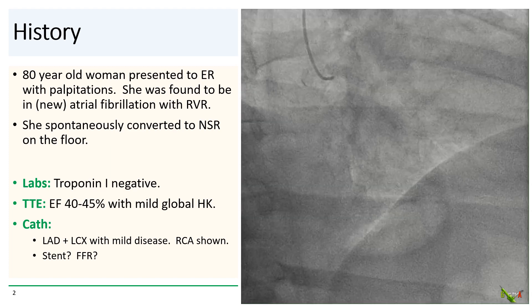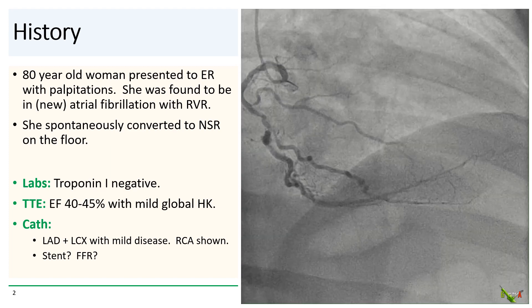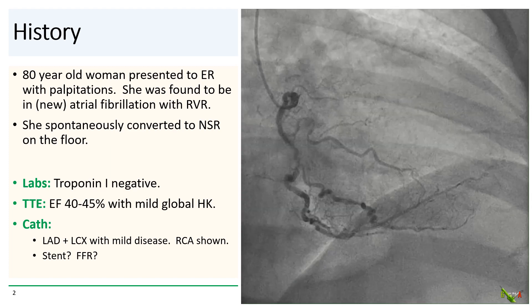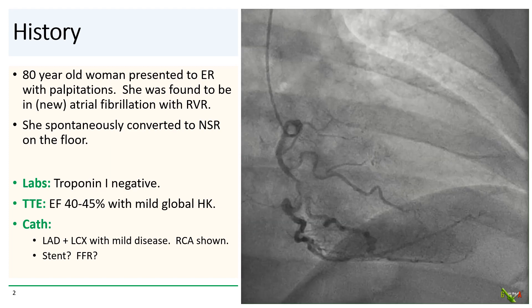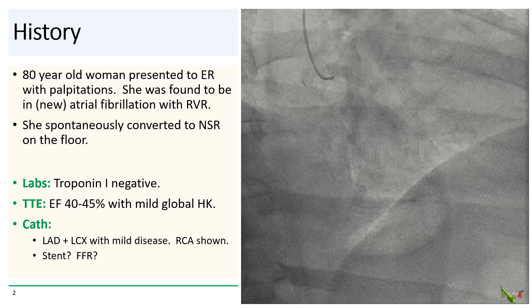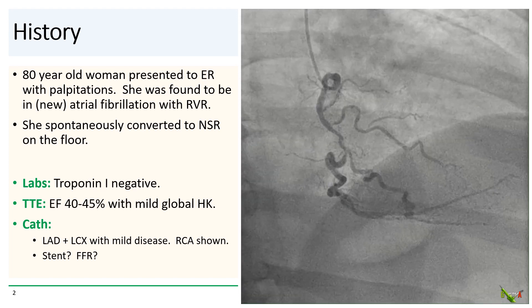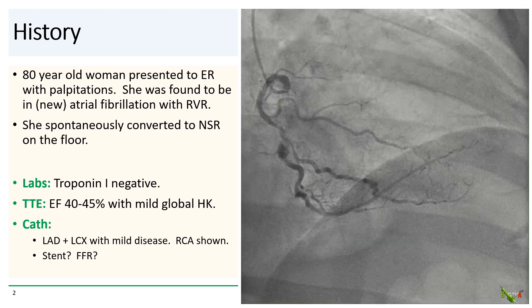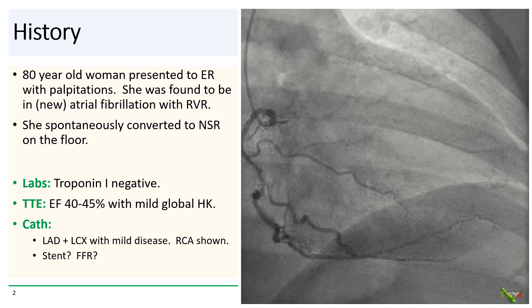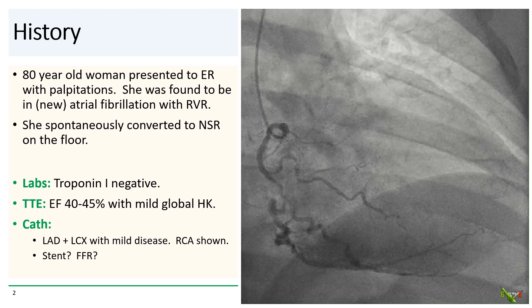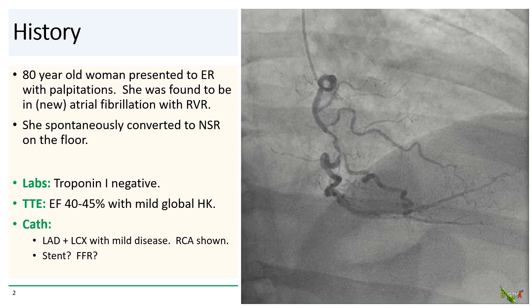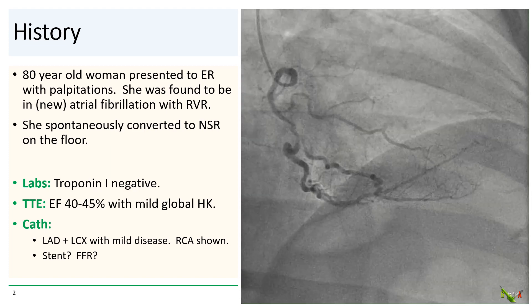She was referred to cath, which showed that the LAD and circumflex have mild disease. We see the RCA here, which is quite tortuous with a segment of disease in its midsection.